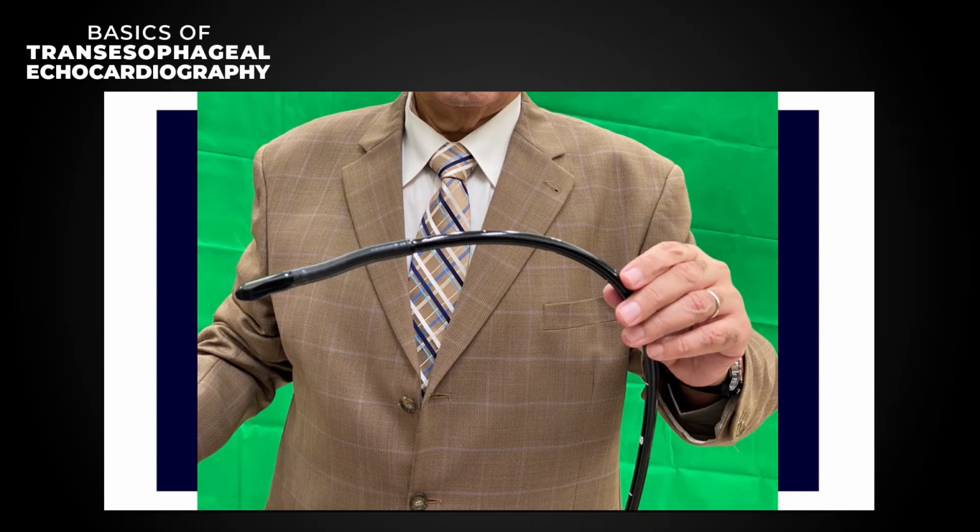Also, if your patient is on oral anticoagulation, it's preferable to check the last INR, because if the patient is over-anticoagulated, you might be surprised by serious bleeding from the esophagus or the pharynx while introducing the probe. So be cautious in patients with dysphagia, those with esophageal varices, and those with overdosing of oral anticoagulation.